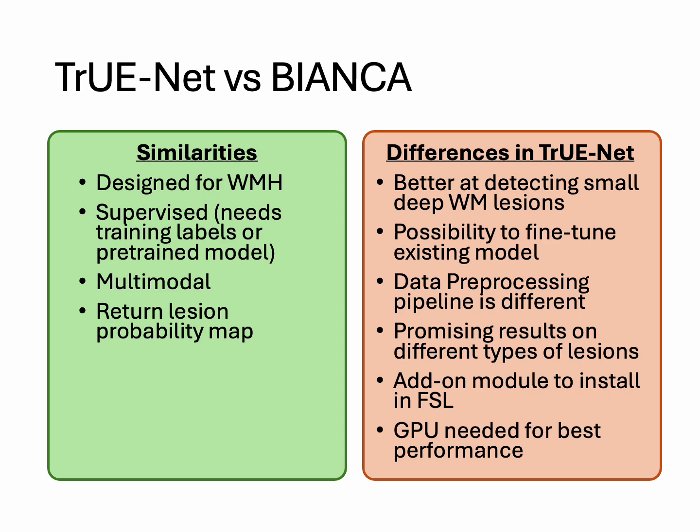The data preprocessing pipeline is slightly different because you need to add distance maps, which is included in the methodology of TrUE-Net. We will also see that in detail in the upcoming slides. And there are promising results on different types of lesions. Not only on hyperintensities, even though it's predominantly developed for hyperintensities, we have obtained some promising results on MS lesions as well, among other types. But even among hyperintensities, we have obtained promising results in deep lesions.